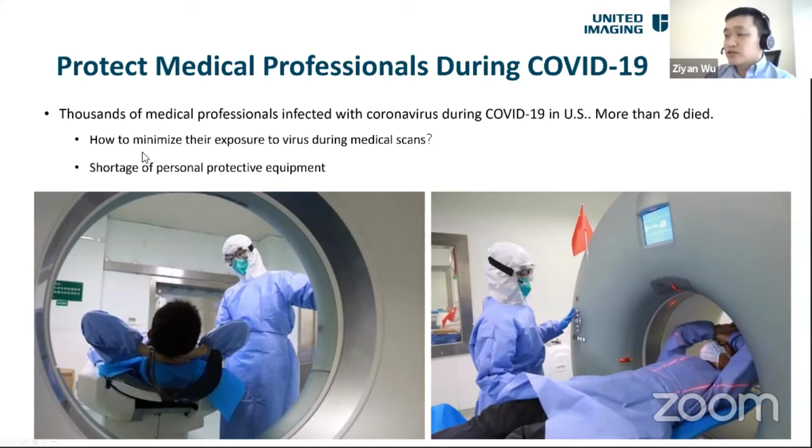during medical scans. As we know, CT and X-ray are the two main modalities used to diagnose COVID-19. And take CT as an example. In the scanning process, the technicians or radiologists are heavily involved in the scanning workflow.